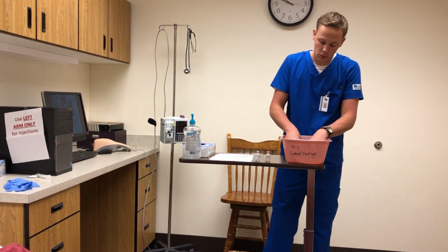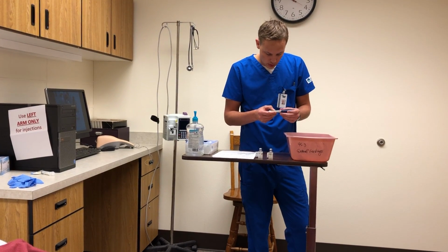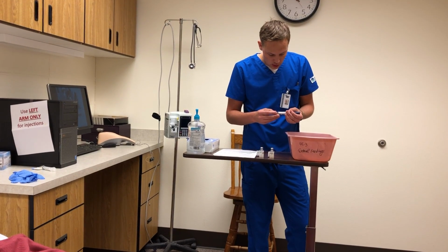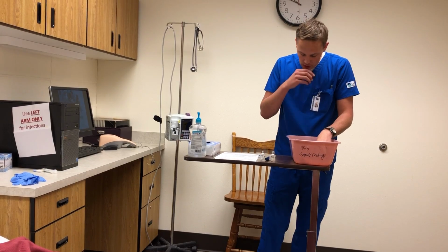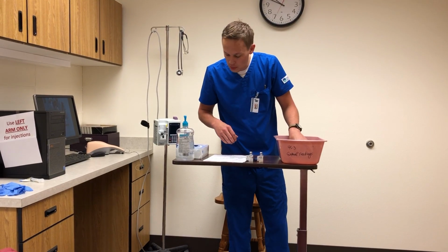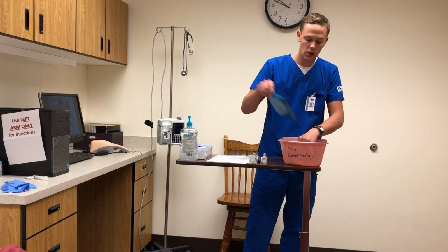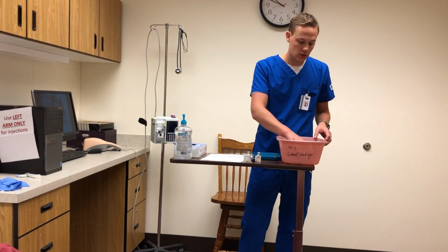So it must be what this is. So Lispro U100 insulin pen, and then okay. So that's all hers. And so that would round out my first med check, and so then I can go on to my second one and get out this tray because I'm going to be taking it into the patient's room with me.